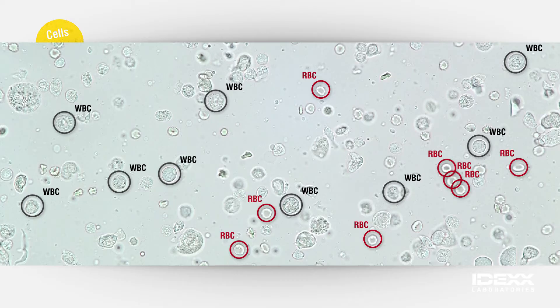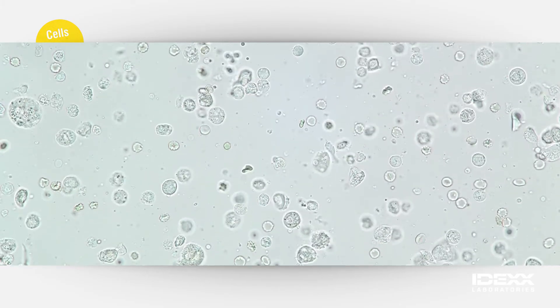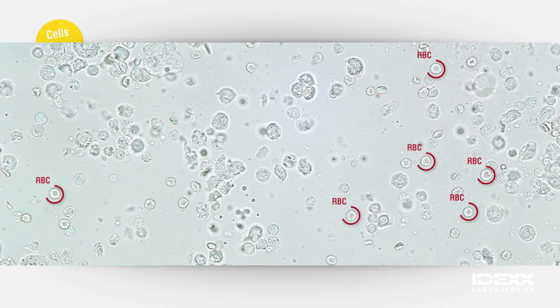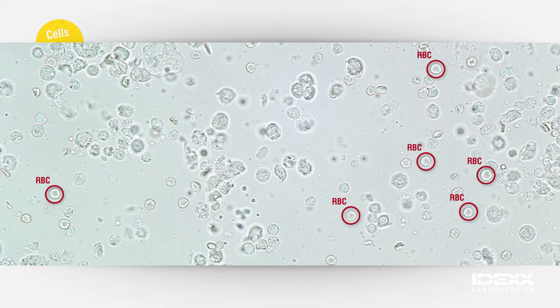The significant numbers of white blood cells indicates the presence of inflammation, which could be infectious or non-infectious in nature. Red blood cells are commonly seen as a component of the inflammatory process, but they may also be seen as a vastly predominating cell population associated with trauma or possible urinary calculi. The presence of either cell type indicates that further investigation is required.